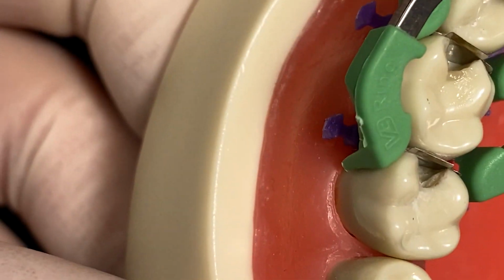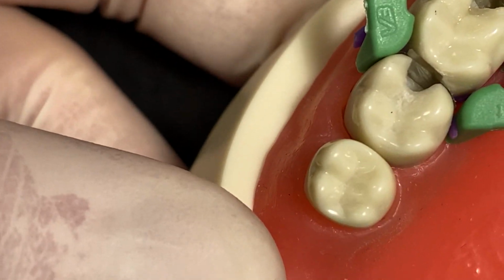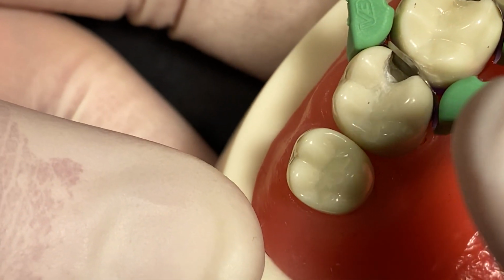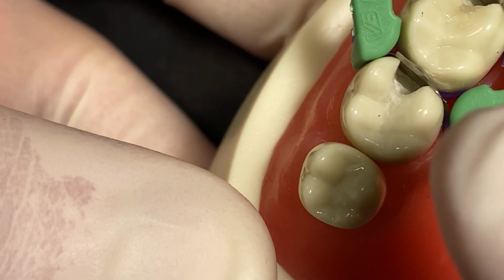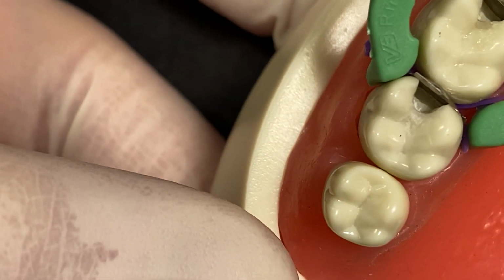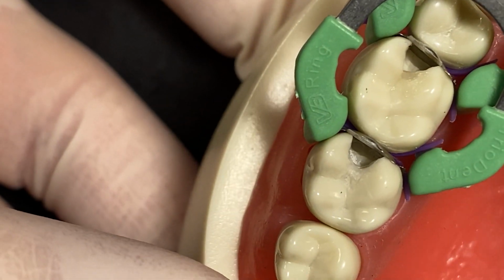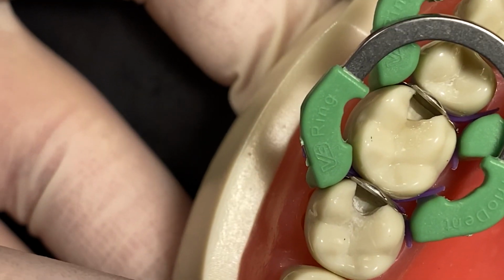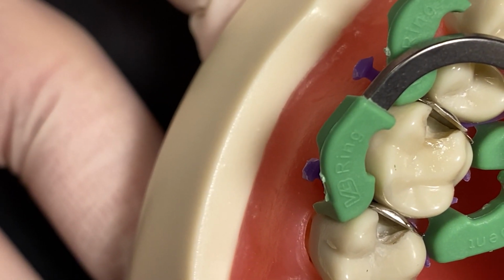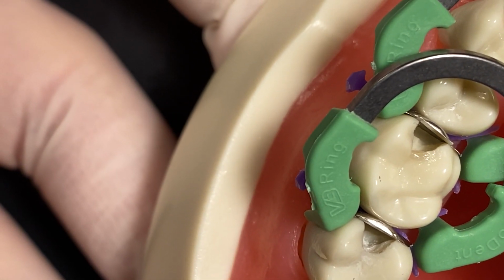And like I've said in previous videos, on this posterior with the ring like this, you've got a really nice area that's well sealed on the axial walls and especially at the gingival margin. If you leave some flash on the occlusal area, that's a quick finish, a few seconds. But if you leave flash down in the gingival box or at those axial line angles at the gingival margin, that's minutes of polishing, and it can be quite cumbersome.